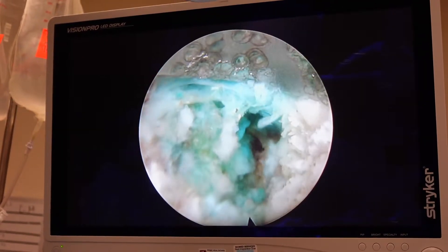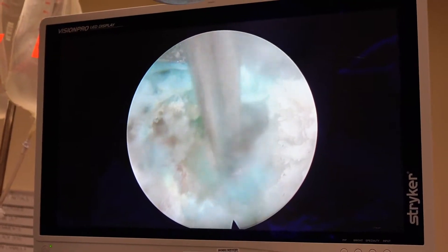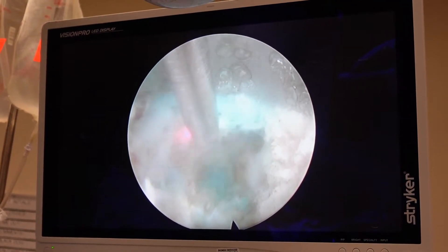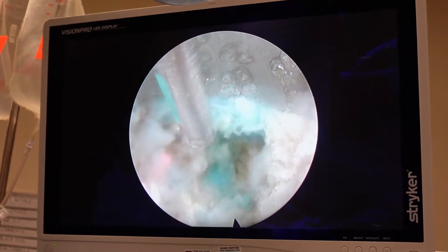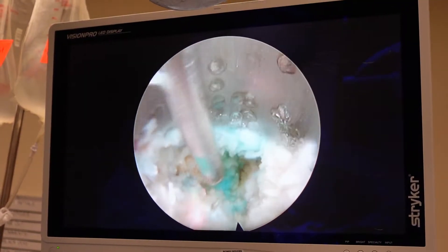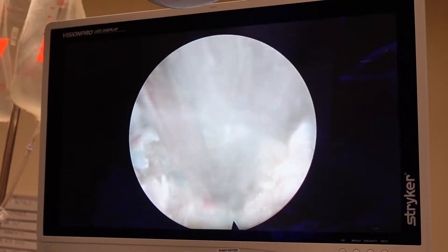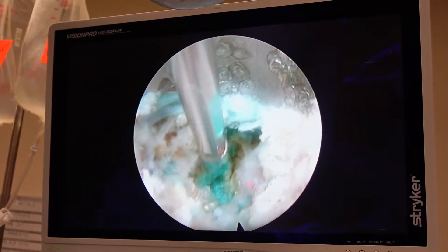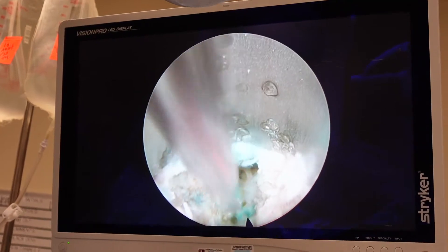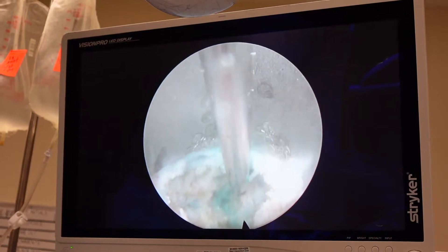I will now take the laser — you'll see how magical this instrument is. One of many instruments I use, but this is the magical one. You're probably wondering where all that tissue goes, how it disappears. Hopefully it won't go up into the sky and rain back down on us like that movie — I think it was called 'Envy' or something with Ben Stiller.